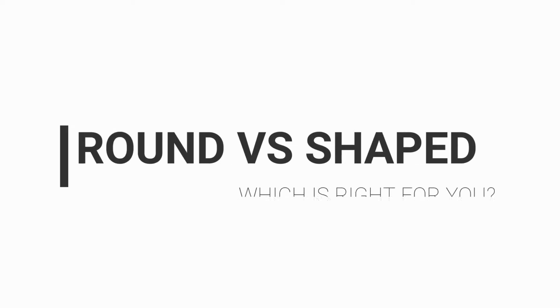On the other hand, with silicone, if you want a really soft breast, silicone more closely replicates the feel of breast tissue. So first we talk about what the material is. What's the inside? What does it feel like?